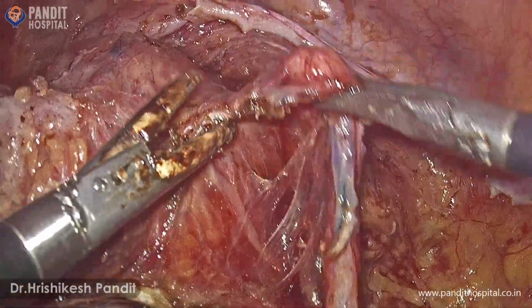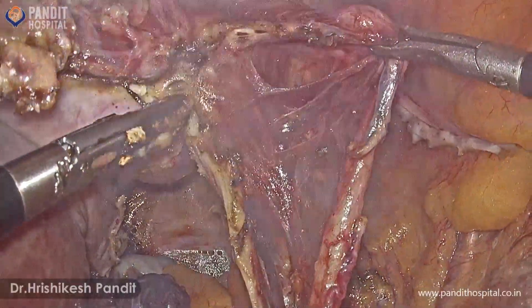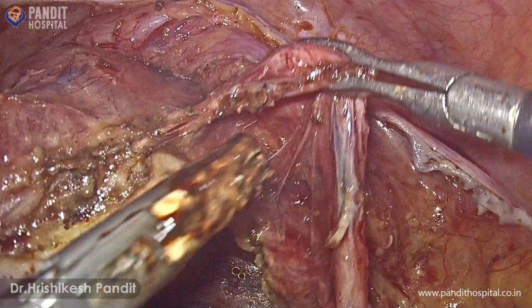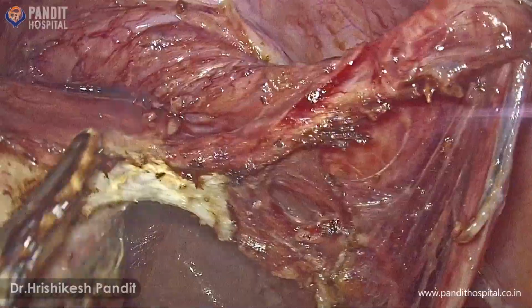In nerve-sparing type of radical hysterectomy, the deep uterine vein is taken medial to the ureter. If we take the deep uterine vein lateral to ureter, it is known as non-nerve sparing type of radical hysterectomy.